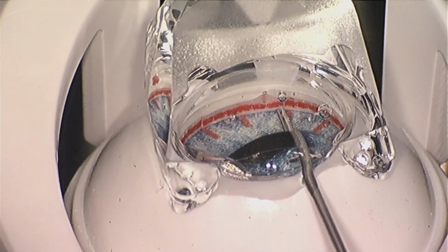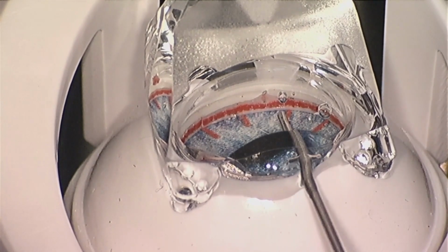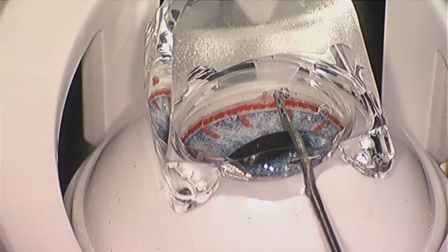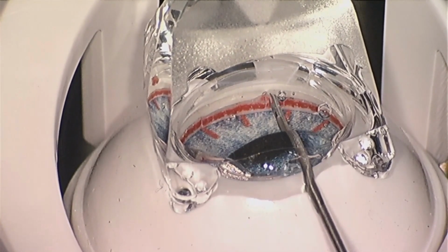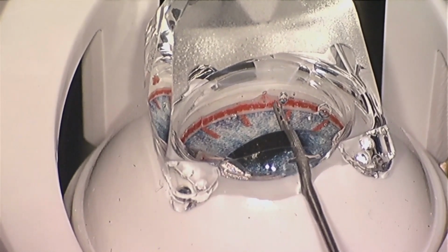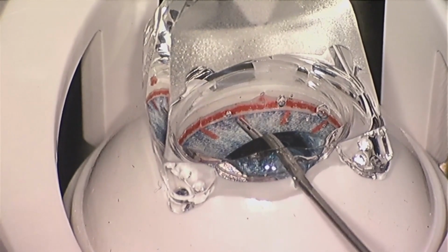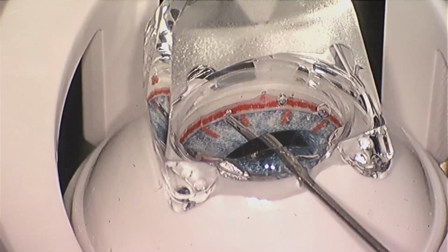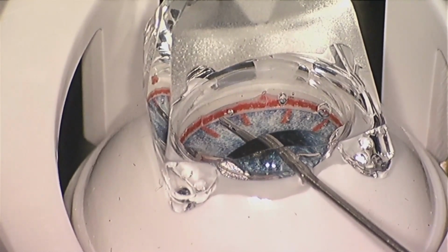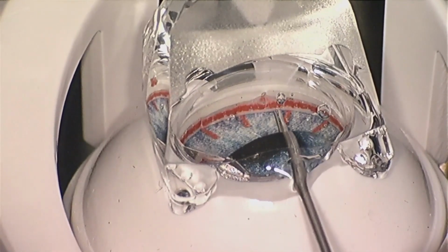And you can see that there's a little notch where you can see down the trocar and can see the two stents in position. And now I'm just gently showing you, if you rotate it to the left or to the right, you can get a better view of that little notch where you can see where the stents are. When you're getting ready to place the stents, you want to have that notch in view so that you can make sure there's no trocar bias. And I'm just demonstrating again, when you move to the left, you might need to rotate the barrel a little bit so you can see that notch.